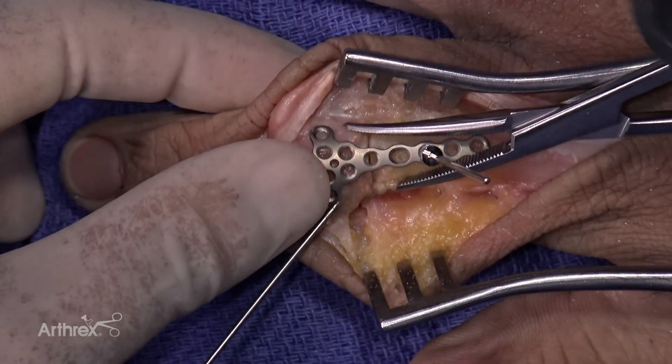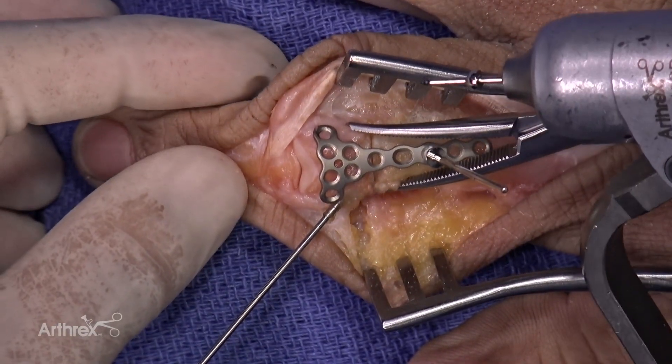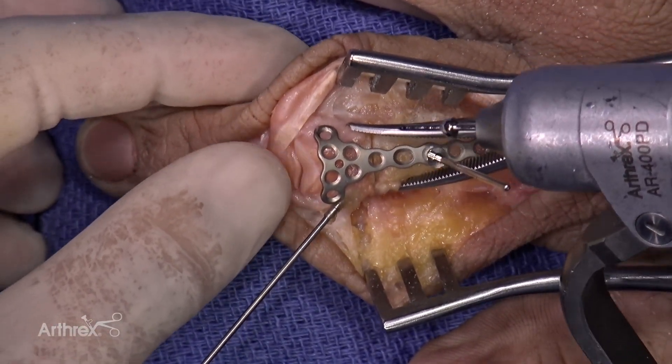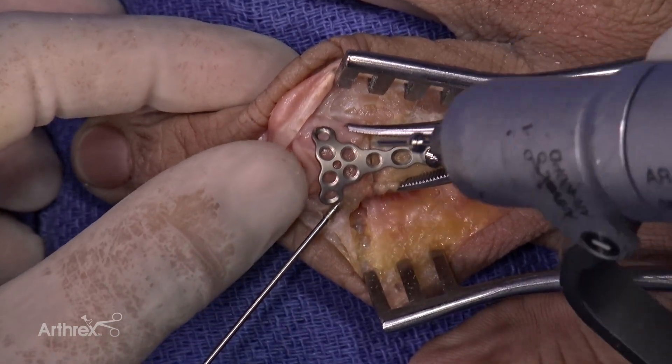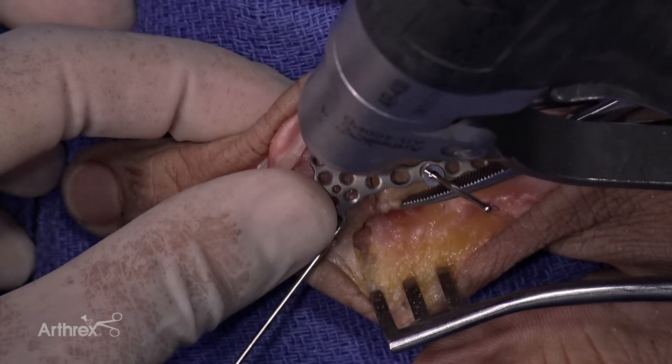I'm going to put another BB tack in distally. Of note, the BB tack is 1.1 millimeters in thickness, which is actually the same size as the drill you can use. So you can go ahead and use the same hole to put in your screw at the same time.